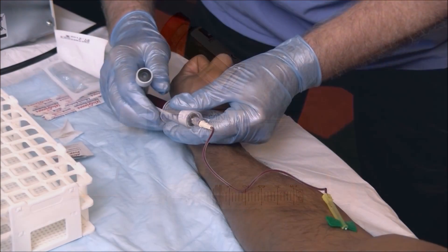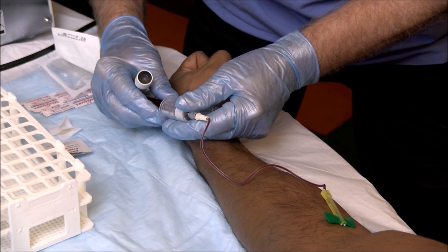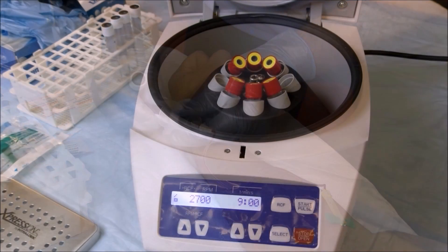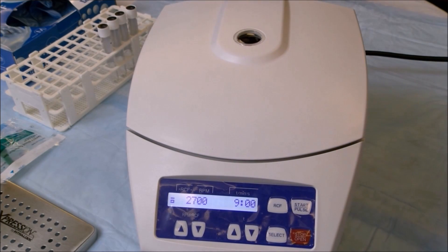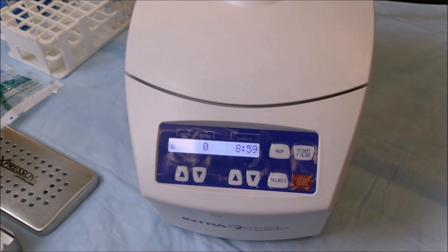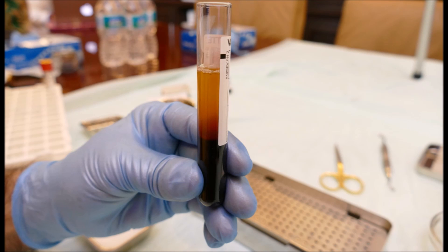Blood is drawn in a normal phlebotomy procedure, with the white top tubes always being drawn last. The vacutainer tubes are placed into the centrifuge in a balanced fashion. The lid is then closed and the spin cycle is initiated. The white top tubes are removed after three minutes.